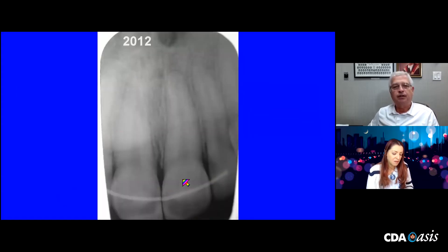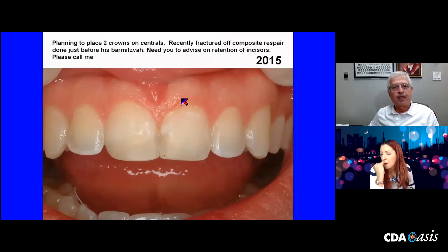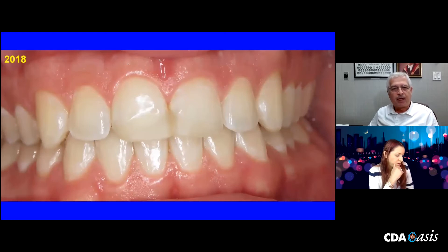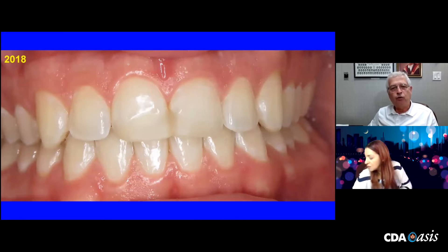He had orthodontics done over the intervening years, and you can see the two retentive wires. As he got older, in 2015, he said he'd like it to look better — he was going off to university at some point. I said, let's put these things off until you're a little bit older, 20, 21, 22. And you can see the orthodontic wire that was placed in 2018 — we're now ready to move ahead.